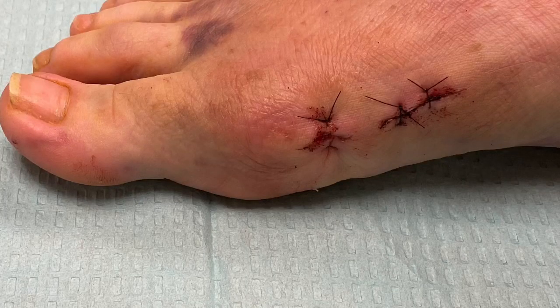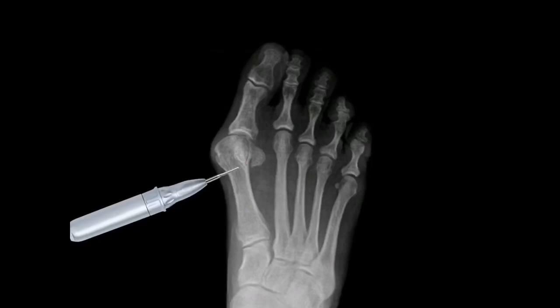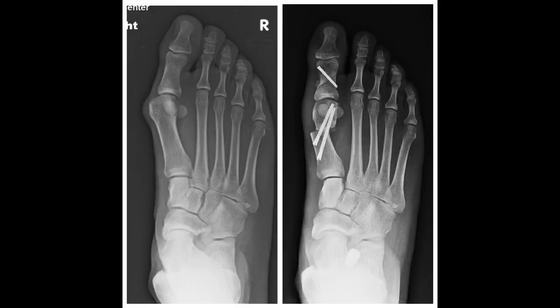The difference is we're using small, tiny stab incisions that allow us access to the metatarsal bone, where we're able to make bone cuts to realign the deformity. Several small screws are inserted again through percutaneous, or small tiny stab incisions through the skin, which allows the correction to be held in place during the healing process.